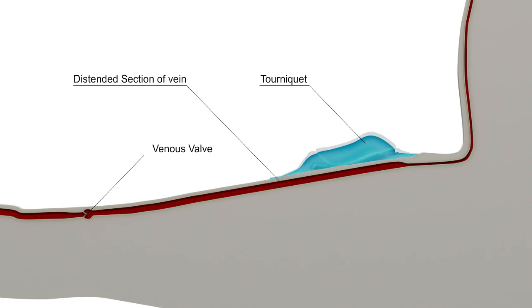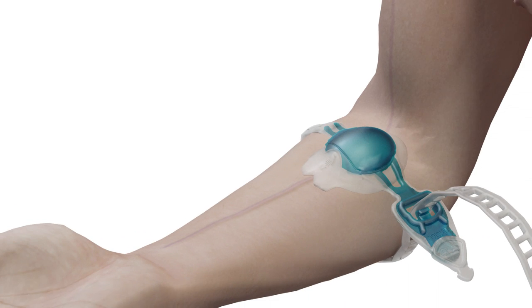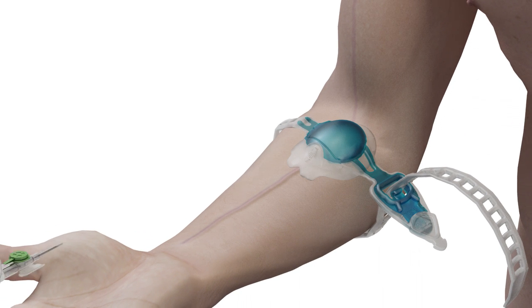Clean the cannulation site and perform additional pumping if required. The cannula should then be inserted approximately 20 to 40 mm in front of the vacuoderm.